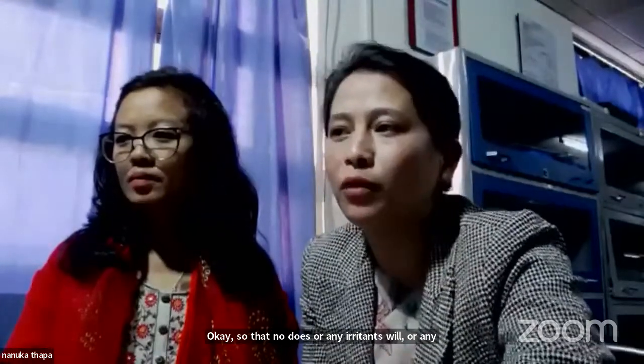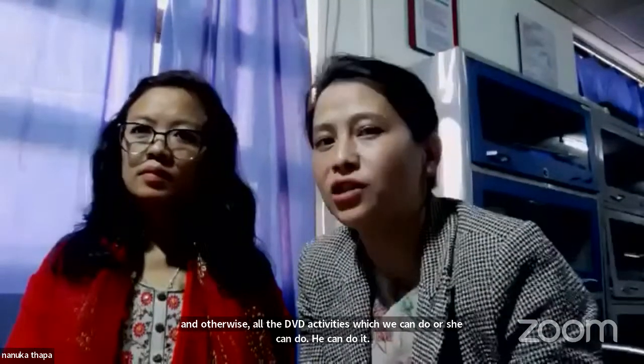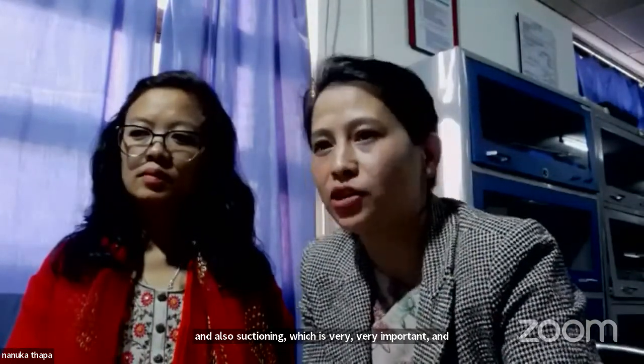One more very important thing: we should always advise the patient not to go swimming. A patient with a tracheostomy tube cannot go swimming. Otherwise, all daily activities he or she can do at home. But the most important thing is to teach them self-care of the tracheostomy and also suctioning, which is very, very important. And you have to advise them to buy a suction machine. It can be electronic or a pump system.